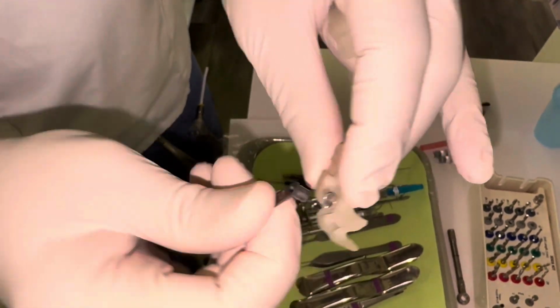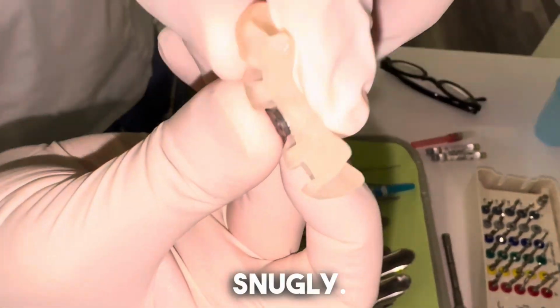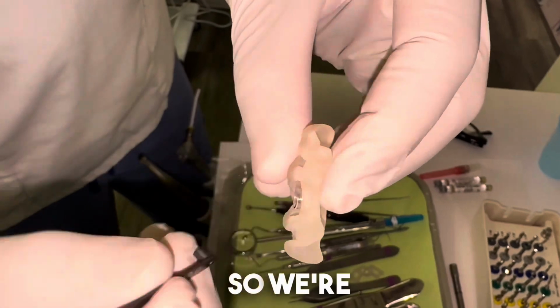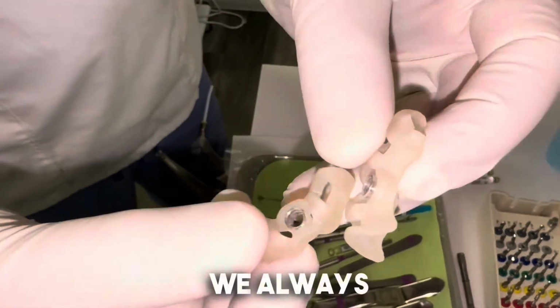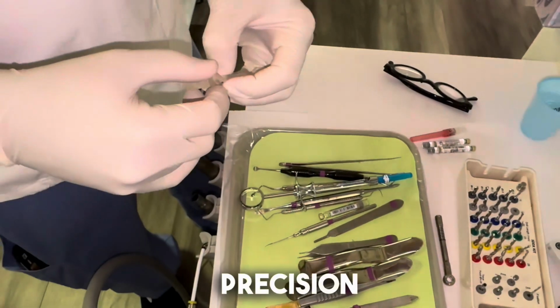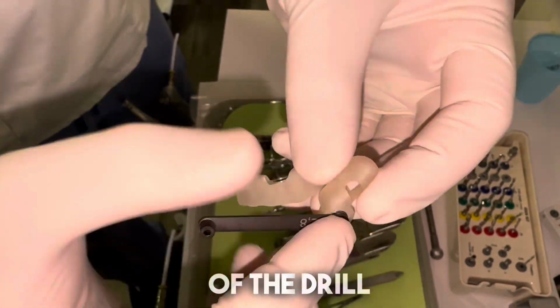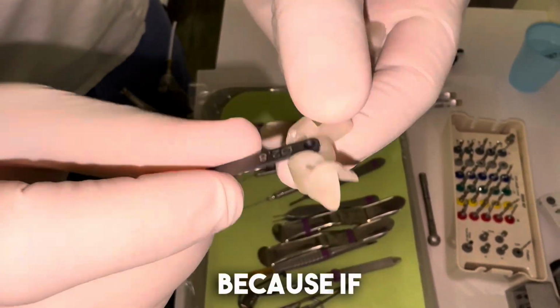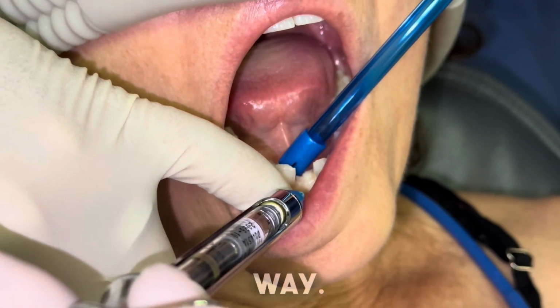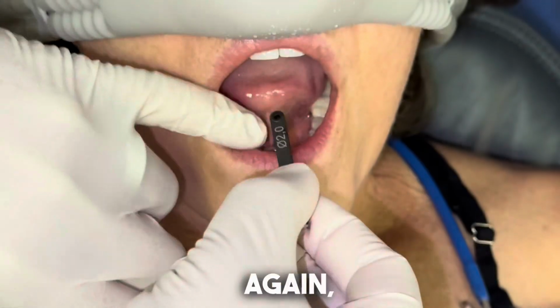We always print two guides, and one of the guides, the sleeve didn't fit snugly, so I'm showing you the one that fits snugly, but the other one does not, so we're going to use the one that fits snugly. We always print two just to make sure that this is precision driven and the trajectory of the drill is going to be correct, because if it is off by even a millimeter, the implant is going to go the wrong way. After the local anesthetic, we tried the guide again, fits in.